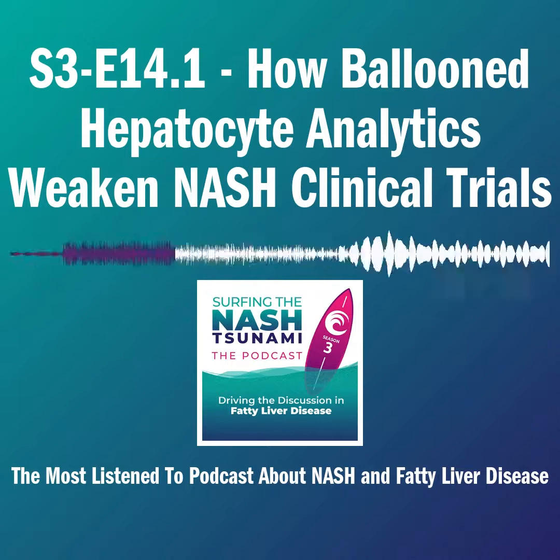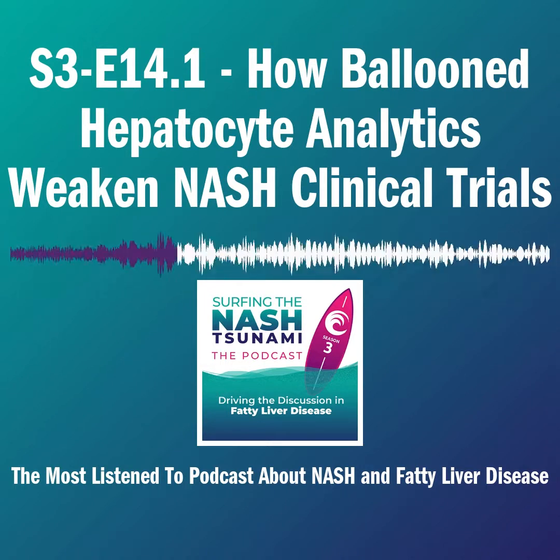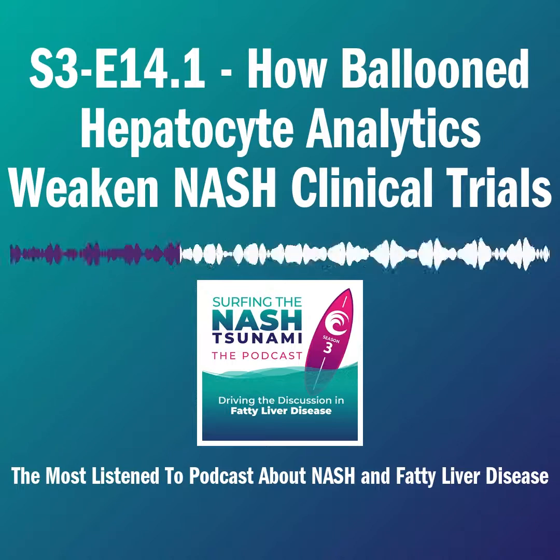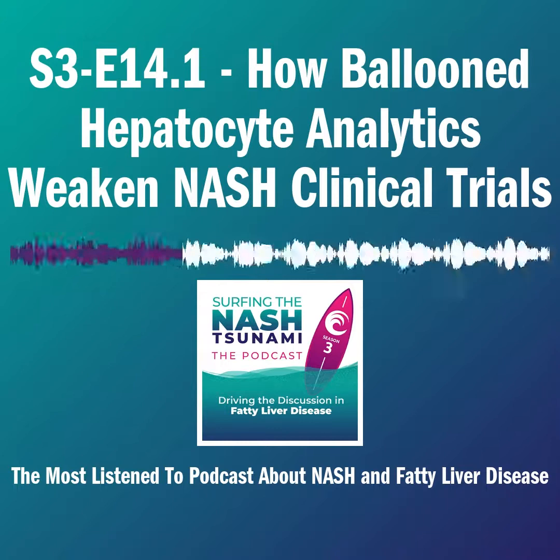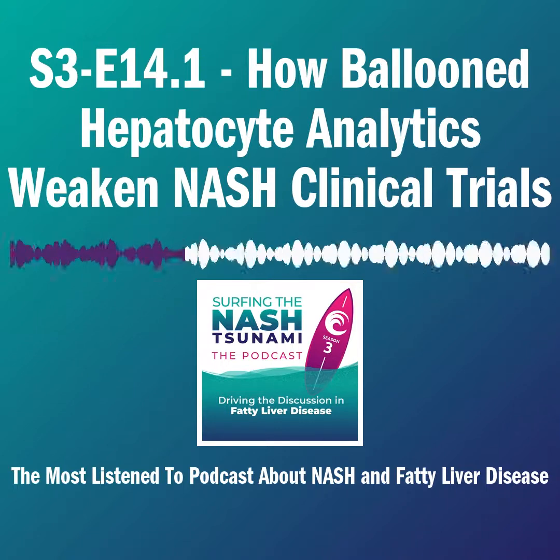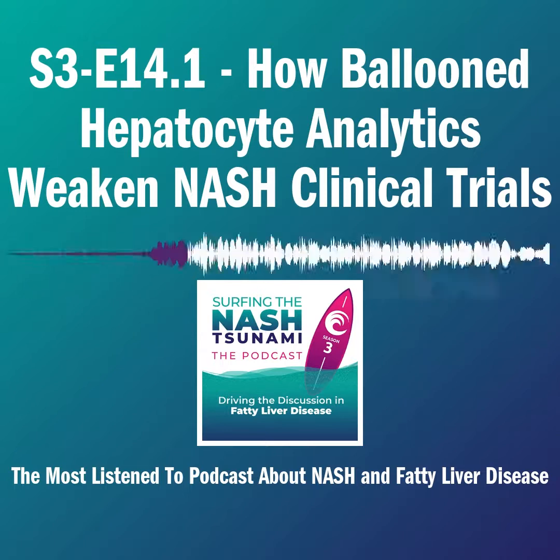So we took 9 of the world's leading pathologists who have been incredibly generous with the amount of time they've given, and we asked them to score 10 liver biopsies, looking at these digitized slides and literally drawing round each cell on those slides that they determined to be a ballooned cell. And they did that independently.